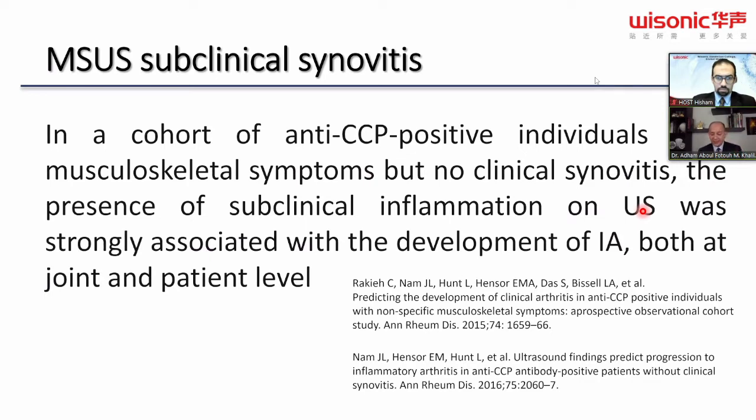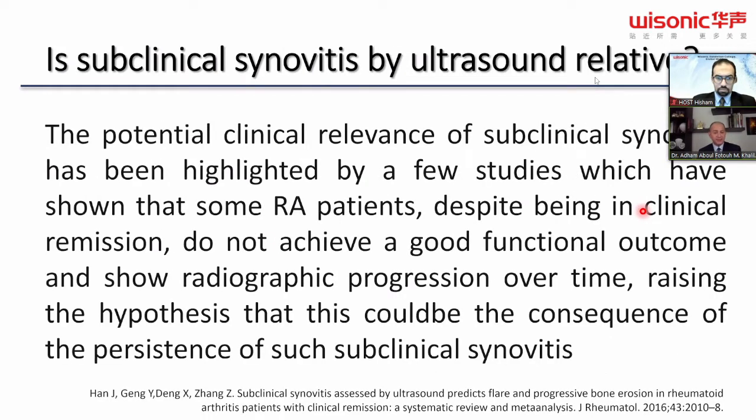And this is a very peculiar differentiation. Is it relevant? Well, yes, there is a potential clinical relevance of subclinical synovitis that is highlighted by studies in rheumatoid arthritis, despite being in clinical remission. They don't achieve good functional outcome.